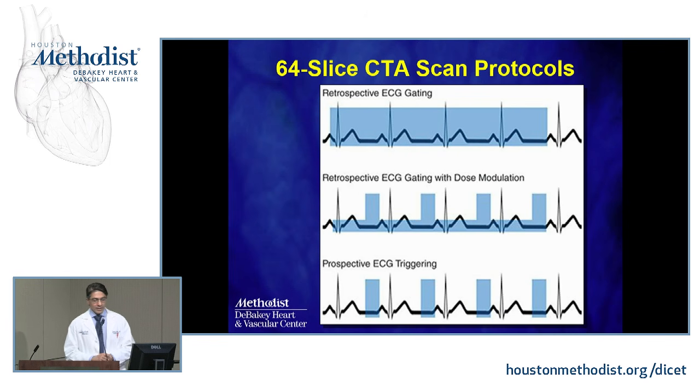All right, so now I divided my talk into how we scan. These are the things that y'all are always asking us, so I had to do it. I think you should know a little bit of history, because these are the scanners that are at most places, not these fancy toys we may have here. So we're going to talk a little about how to scan on the 64 slice. If this makes sense to you, scanning on the dual source will make more sense to you.